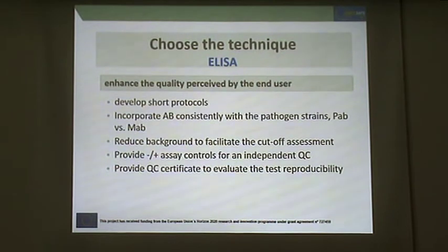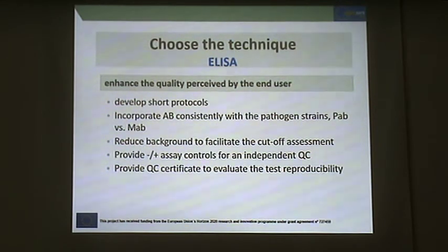And of course, the lowest background and the easy cutoff assessment. And also, it's important to have available the positive and negative control of the assays so they can carry out their own independent quality control and validate the results.